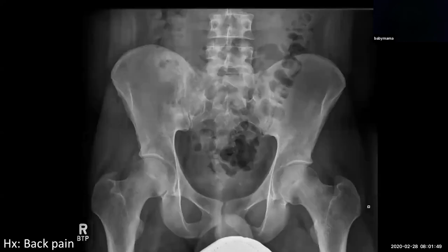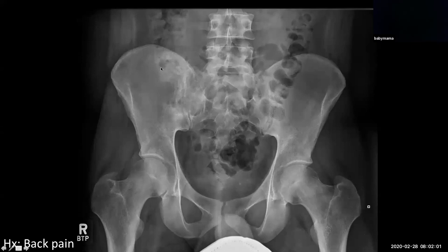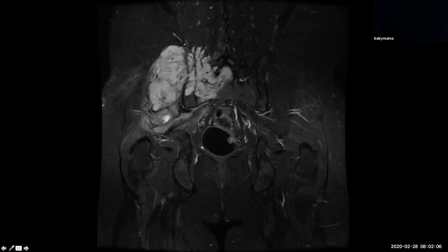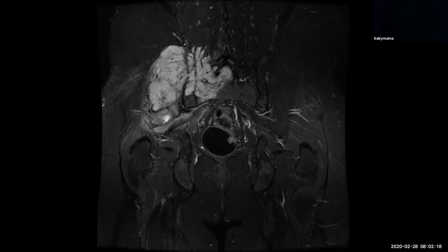We can play a similar game with this patient, also presenting with back pain. There was a lesion here — subtle — but we can see a sort of mottled or mottled appearance at the posterior superior iliac spine and right sacral ala. This was a case of a clear cell chondrosarcoma. If our patients have persistent hip pain or pelvic pain, please consider proceeding to cross-sectional imaging — CT or MRI — as in this case of a clear cell chondrosarcoma.